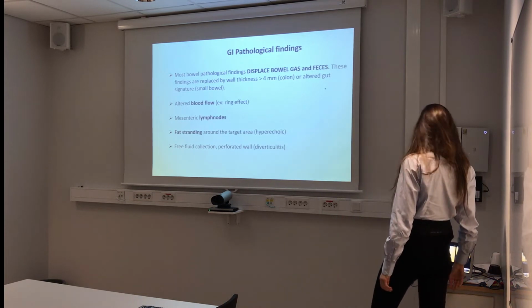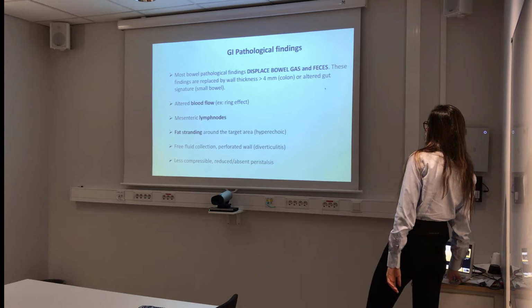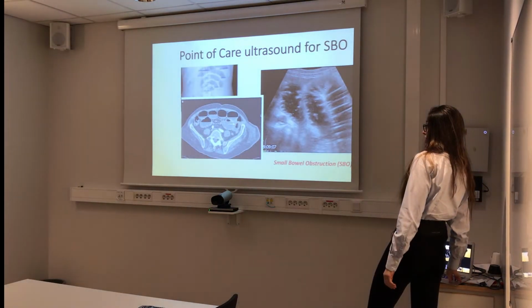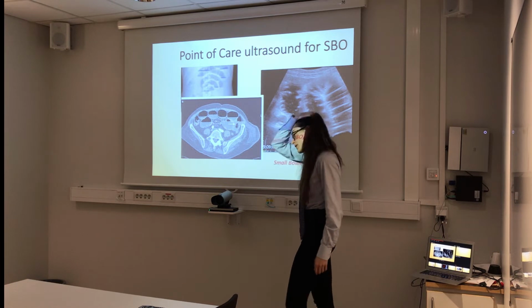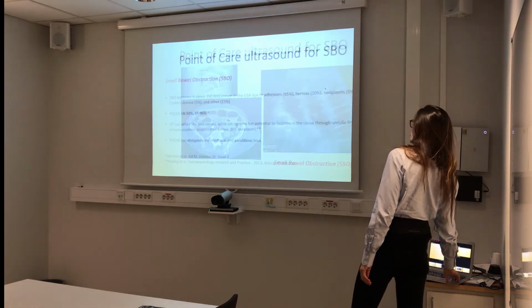Free fluid collection, perforated wall, like in diverticulitis, okay? Less compressible or reduced peristalsis. This is another thing. We will see. Right now, we get to exactly what we want to talk about today, which is the SBO. So how does it look with the ultrasound?